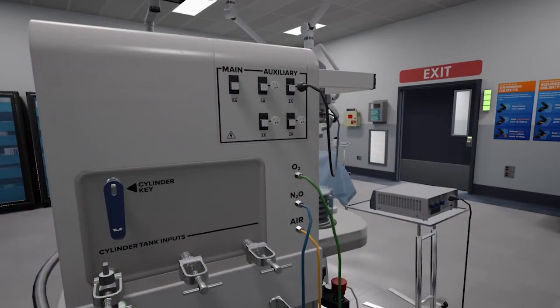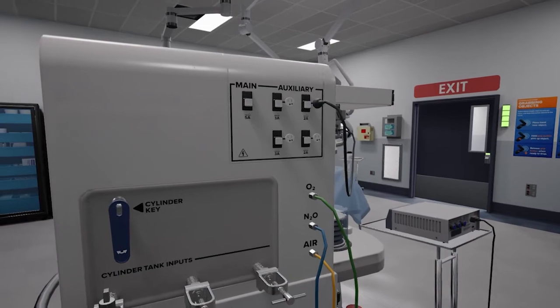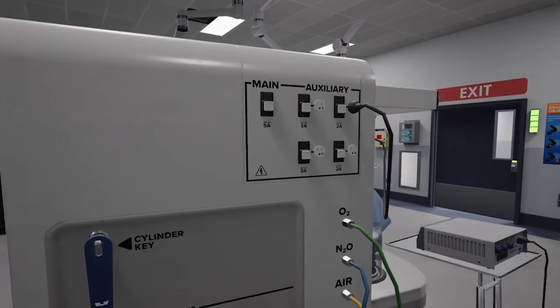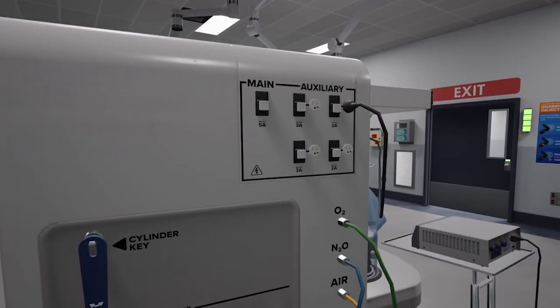However, if other devices are plugged into the back of our anesthesia machine, that's going to decrease the amount of power that we have to supply anesthesia, to use our ventilator, to use our monitors, and that could present a safety risk to our patient.